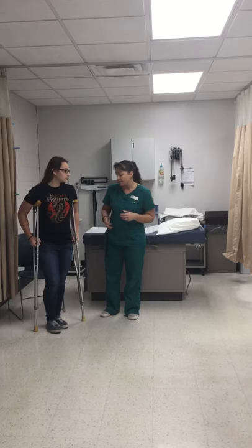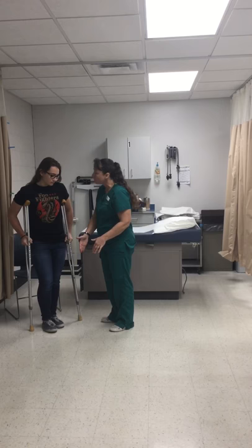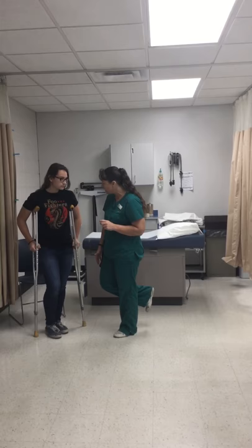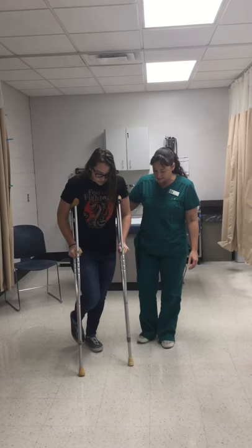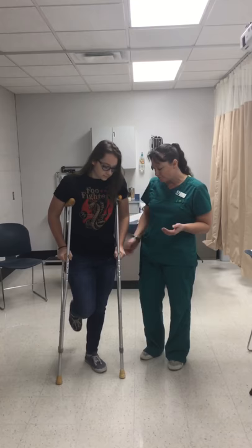Alright Erin, I don't want you to move yet, but I'm going to have you move the crutches forward about six inches, then keep your bad ankle held up, and with your good ankle swing to even with the crutches. Just little baby steps at a time. Go ahead and swing right too. There you go — very good, excellent. We want to watch the patient, see if they have any questions, see if things feel comfortable, and make sure they're putting their weight on their hands and not in the armpit.